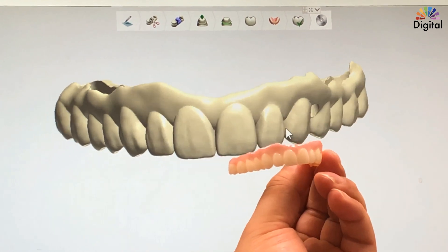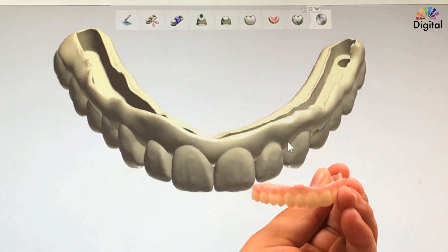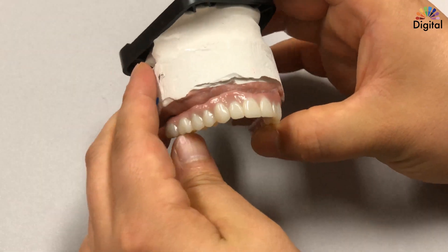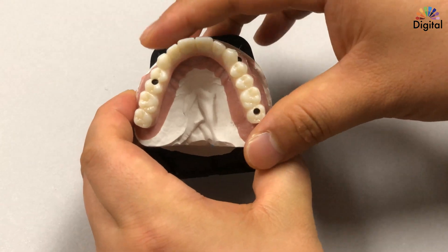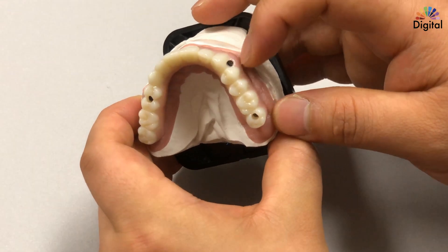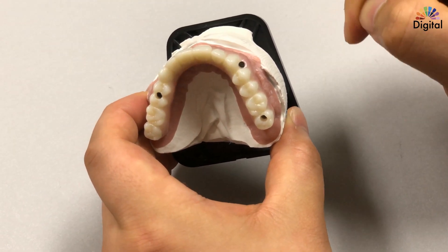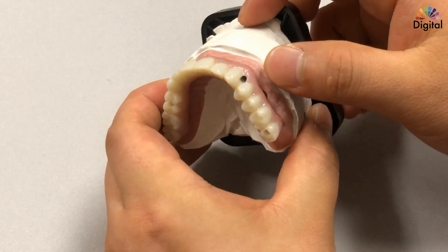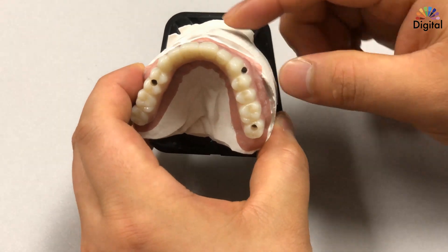After all the pink porcelain, stain, and glaze work is done, just before cement we have three places for the holes. I tried to make numbers 11 and 12 like a practice style with a separate crown on top of the prep teeth, but the screw hole channel came out on the pink porcelain. So I decided to leave it as a full contour crown — the doctor will cover it with pink resin for delivery.